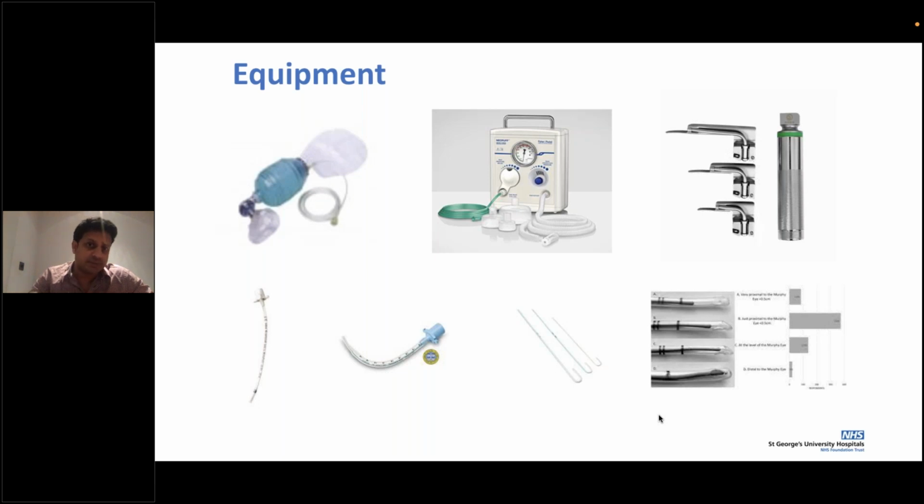If they're very premature, it's about ensuring the neopuff is set up, basically the middle picture that has been put in. I'm not really sure whether you can see my cursor. That in itself will have a PEEP adjusted to it, and checking your equipment.